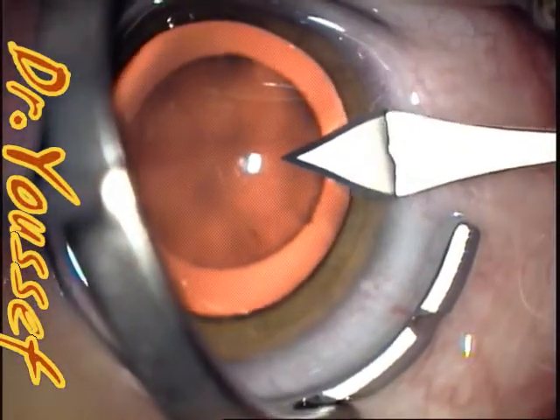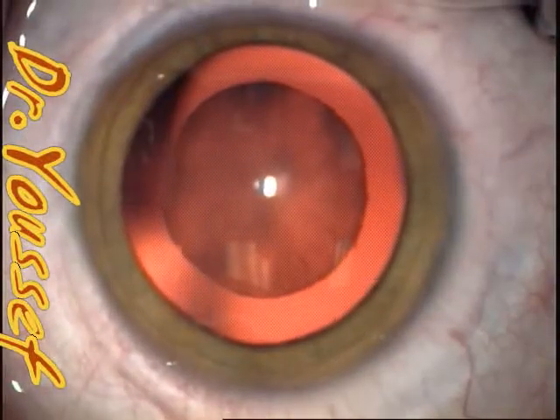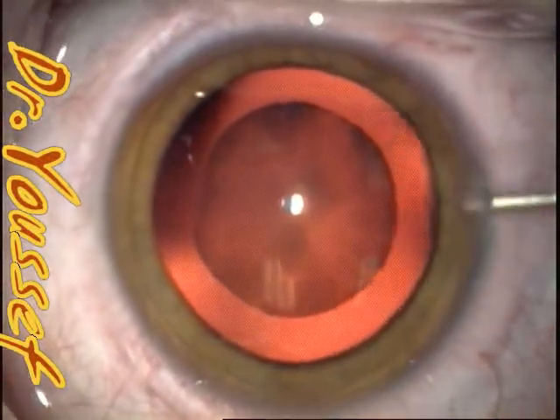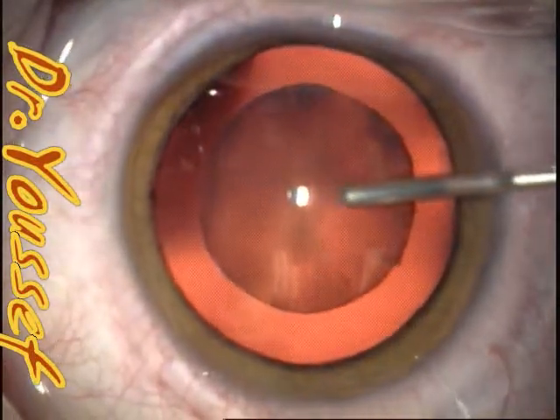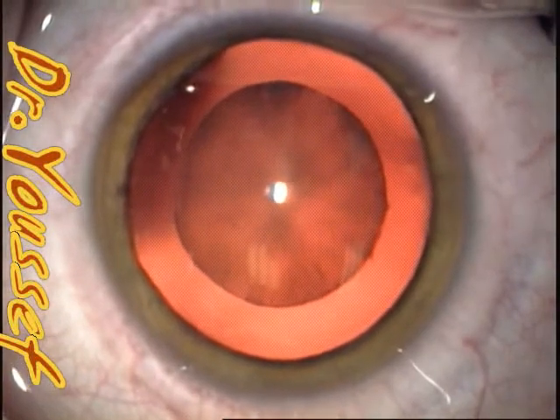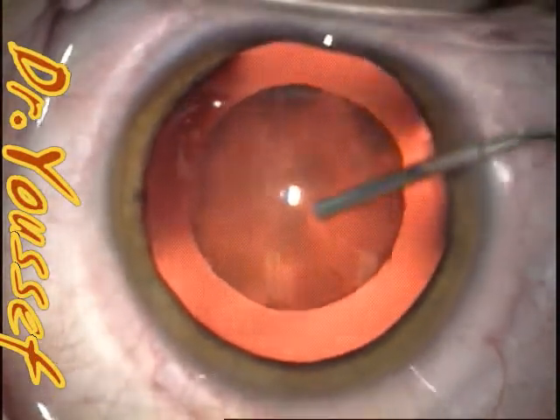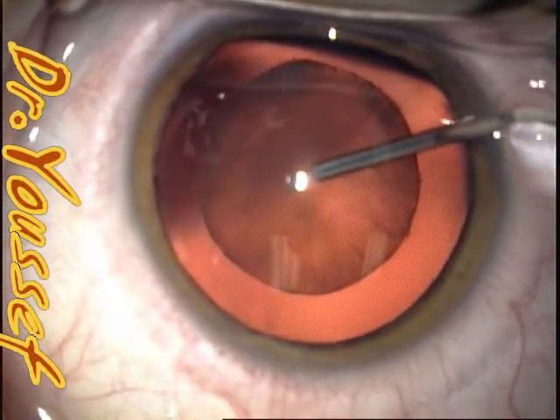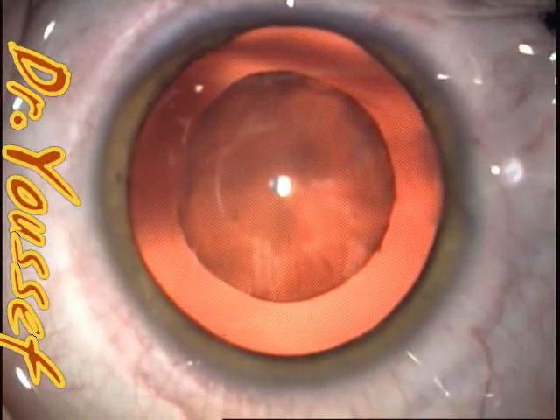This case will start as usual. You can use a superior incision to be underneath the upper lid, but you can also use the temporal. I'm more comfortable with temporal incision. We'll inject Vitrax into the anterior chamber. The capsules here are very elastic and tricky, so I'll use Helon-5 to avoid a runaway rhexis.